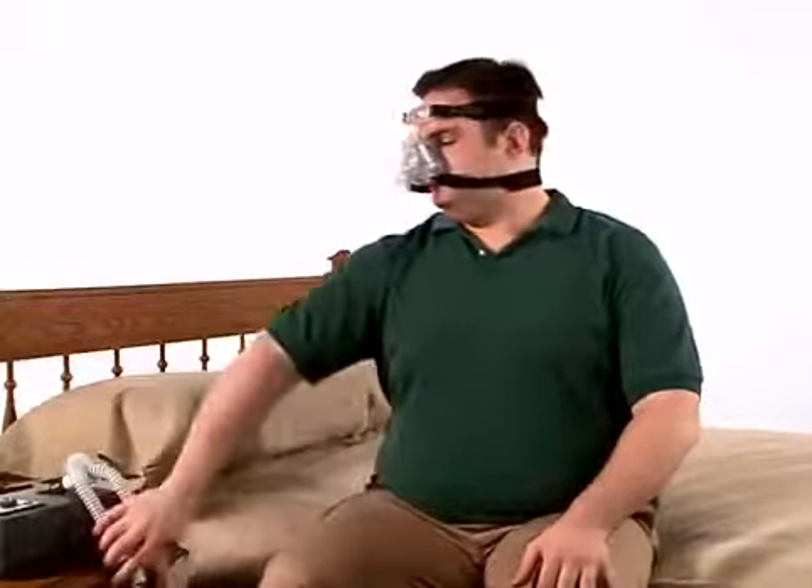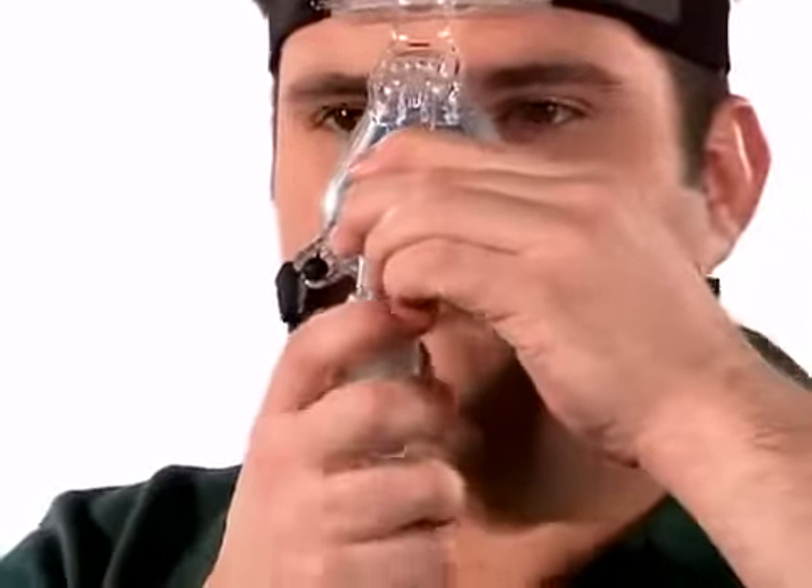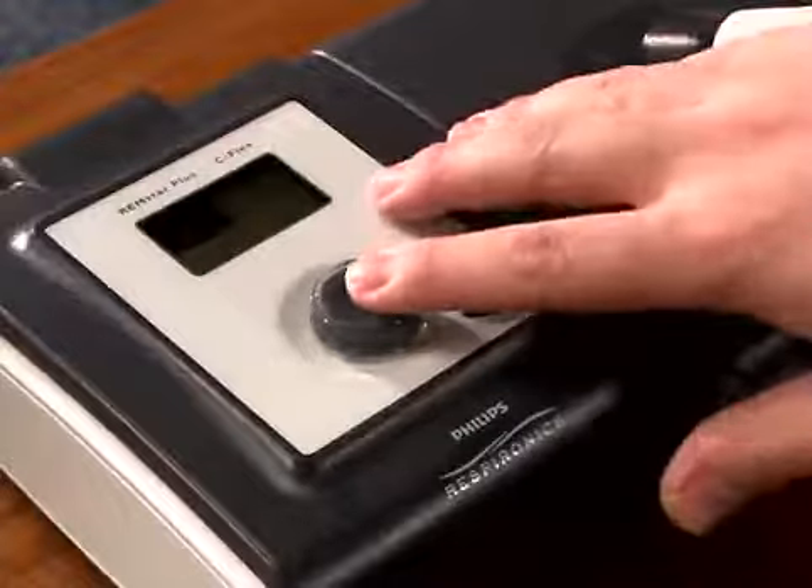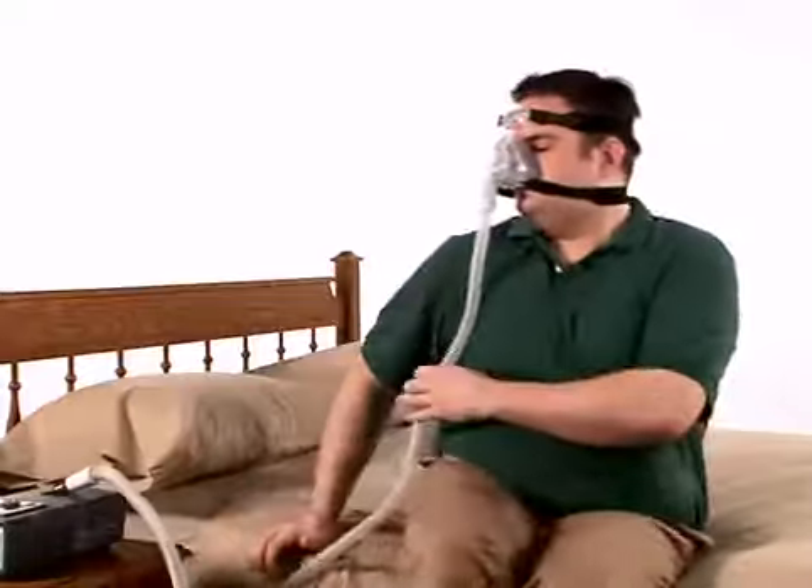We recommend that you make the final adjustments while you are lying down. Connect the tubing to the device and to the swivel elbow on the mask. Turn on the airflow, lie down, and breathe normally through your nose, keeping your lips closed.